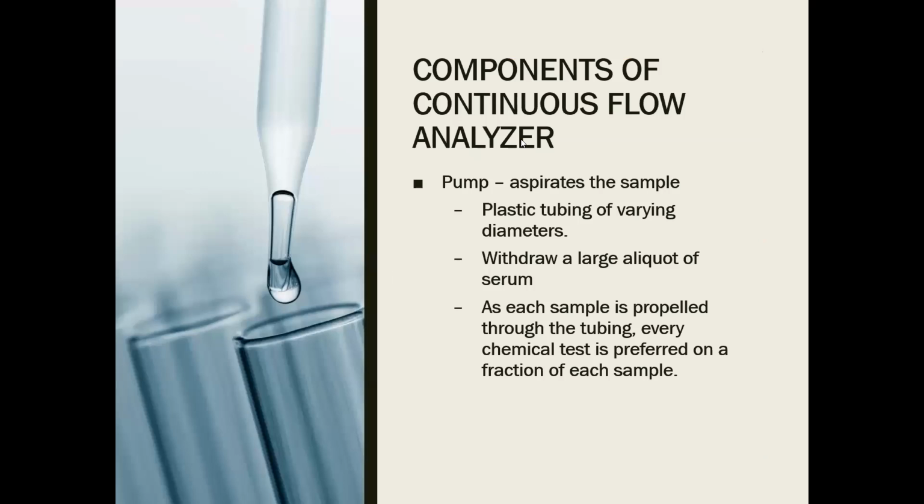Moving forward, no, we have the pump. So sabi natin kanina, si continuous flow analyzer, yung fluid ay meron siyang continuous tubing, no? Na pinapump po doon yung ating fluid sa continuous tubing. When we said pump, that is the one that aspirates the sample. No, the pump can be a plastic tubing or plastic tubing of varying diameters. So pwedeng maliit, malaki, depende po sa machine that you are going to use.